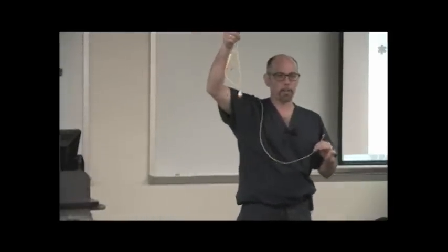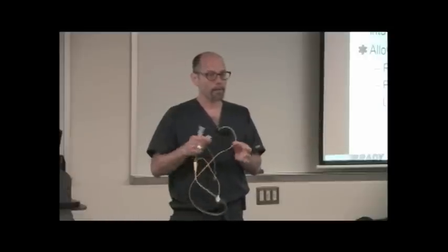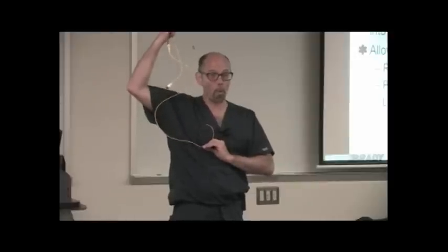Timing how long it takes 10 mLs of room temperature saline to get from the right atrium to clear all the way past the distal tip of this. It's a big, long mathematical formula that you would never be expected to know, but suffice it to say, it gives us our cardiac output, all right? So with this catheter, I can measure right-sided preload, left-sided preload. I can measure pressures in the pulmonary artery, and I can determine the patient's stroke volume and cardiac output. So I can really see how the heart is functioning, but in an extremely invasive way, right?